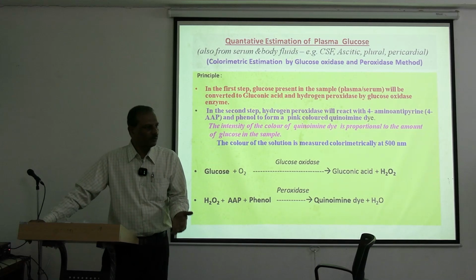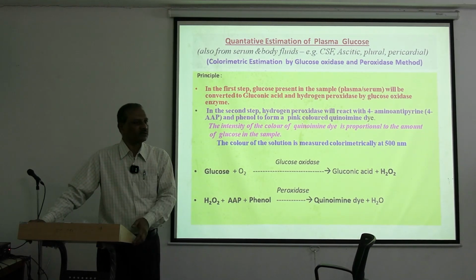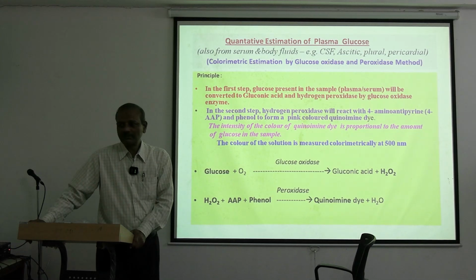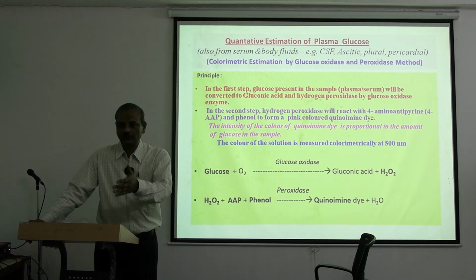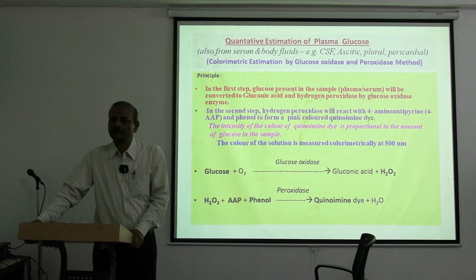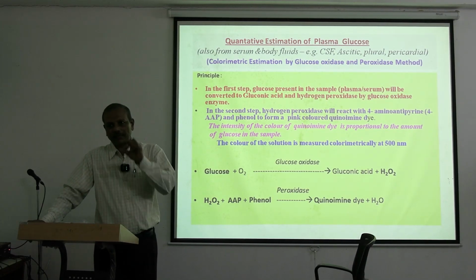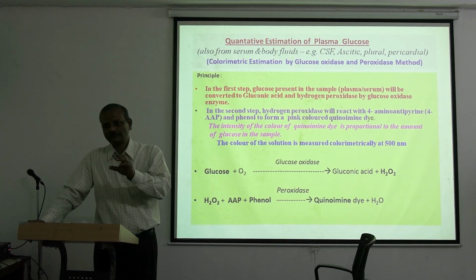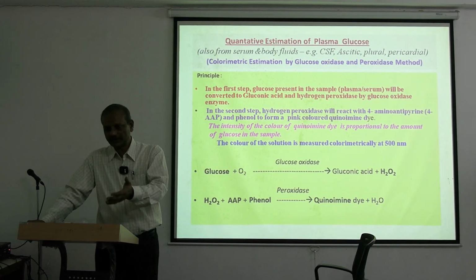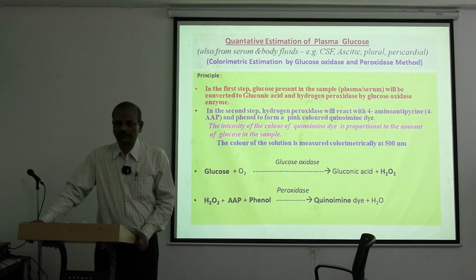You have put your body on a weighing machine and you are seeing the record. What is the actual weight? Because from an apparent look, somebody might seem to have more weight, but if you put that person on the weighing machine, it will give the right amount, the actual body weight. Similarly, in a solution or in blood, we will be examining blood. In that blood, what is the amount of glucose?